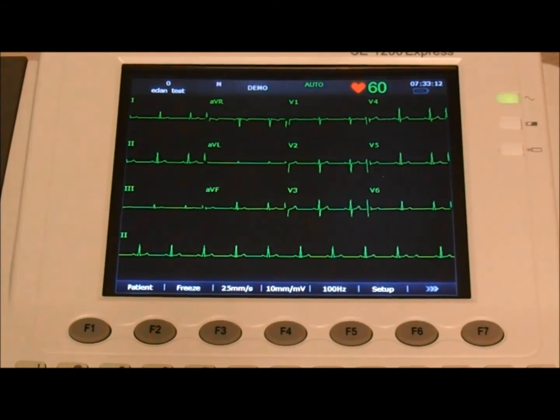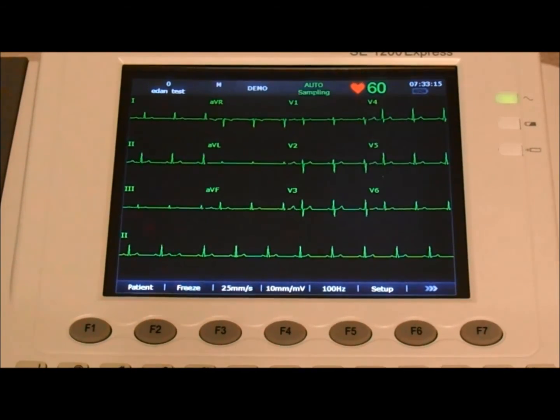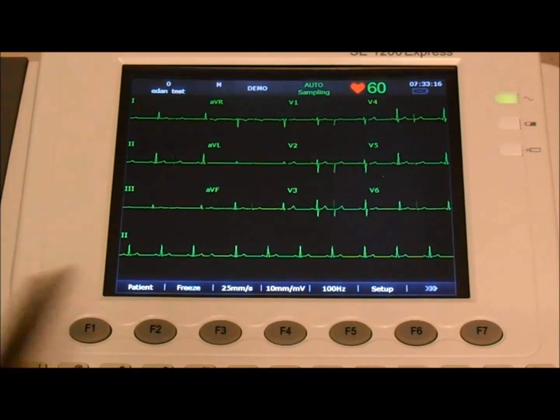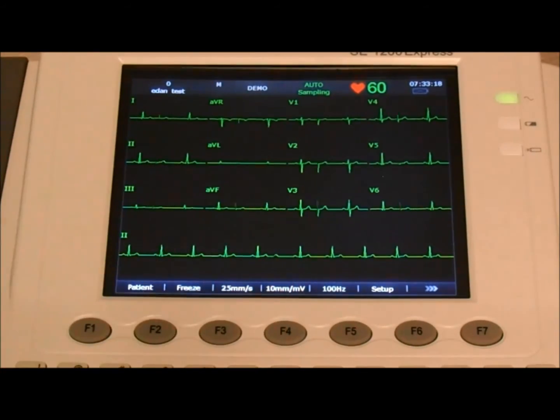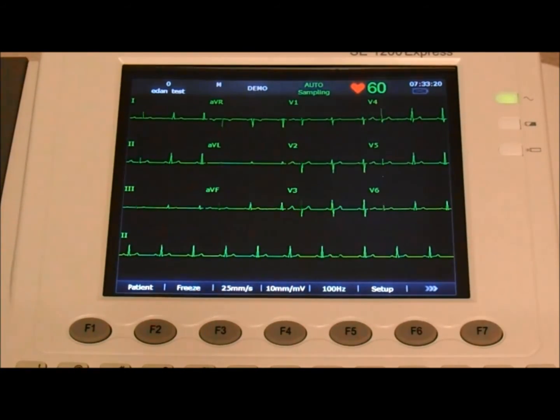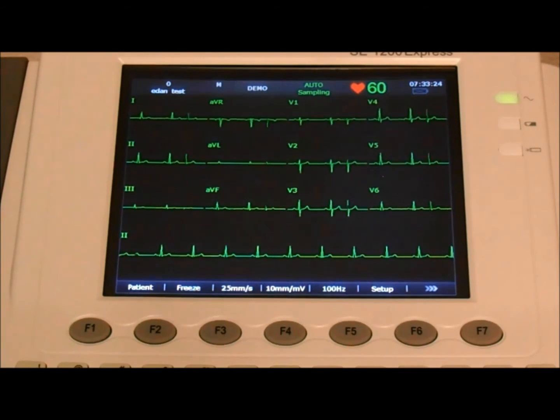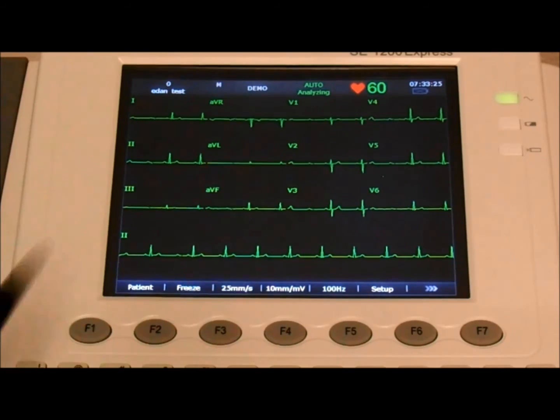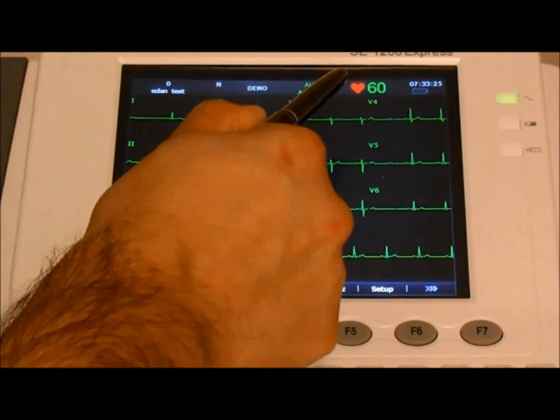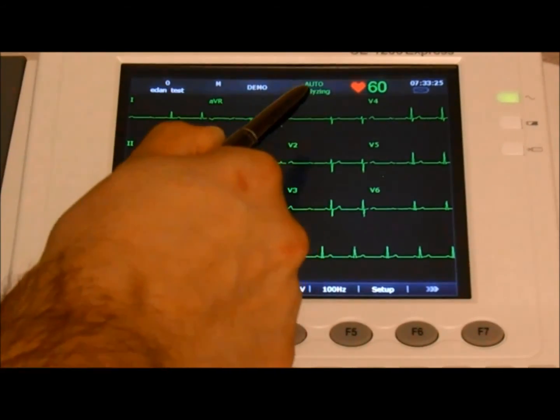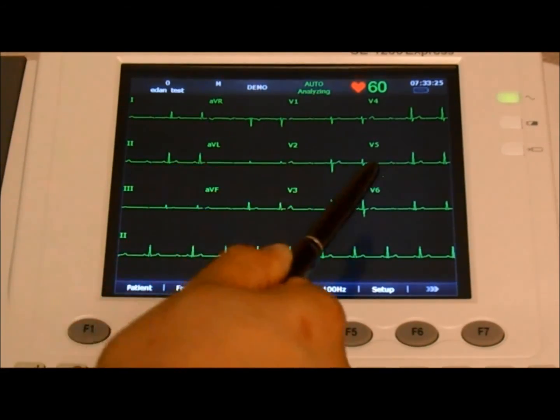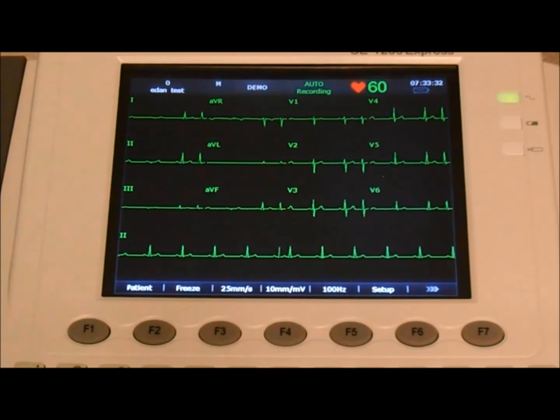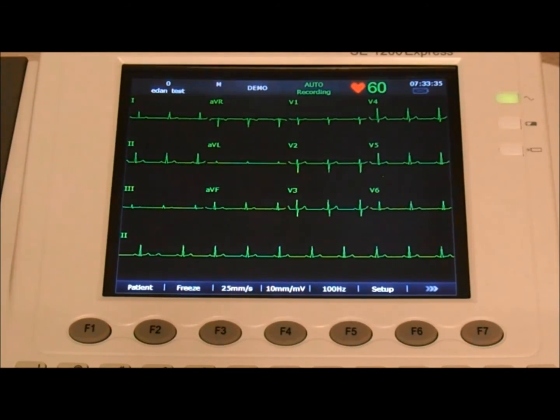And all that you have to do is simply press the print stop. So we press it. Now the system is sampling. It will sample for 10 seconds. Now it's analyzing. And now it will automatically record the report.